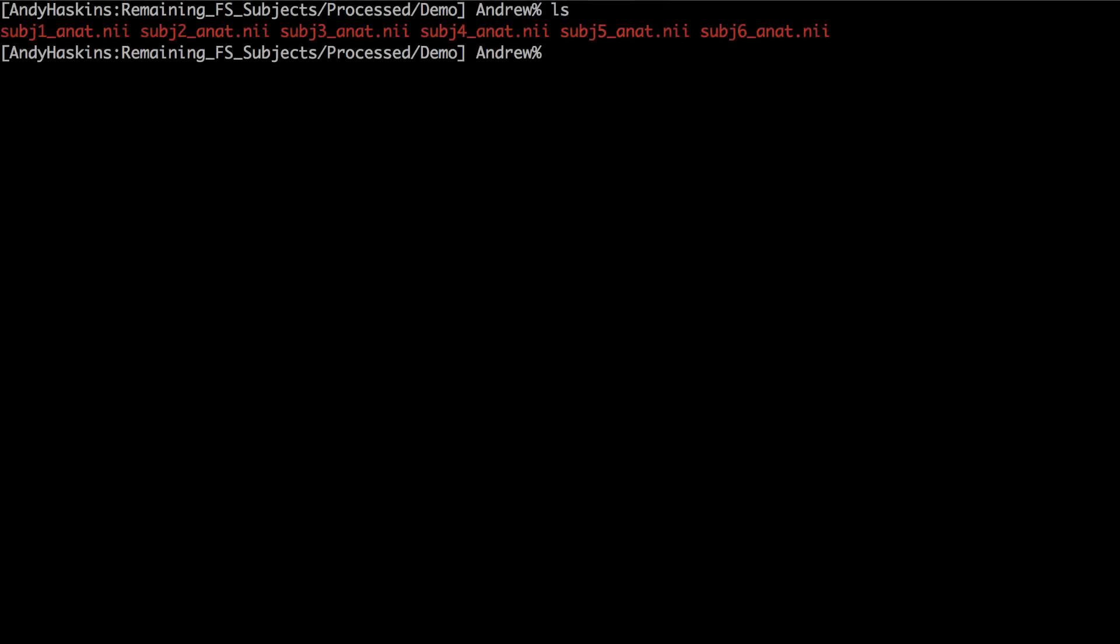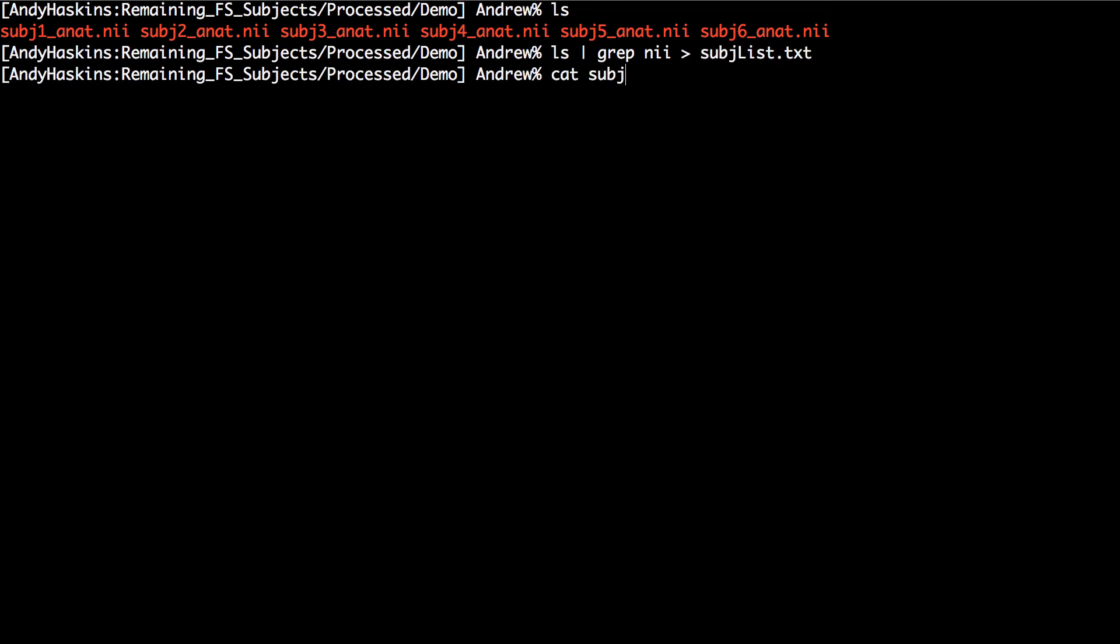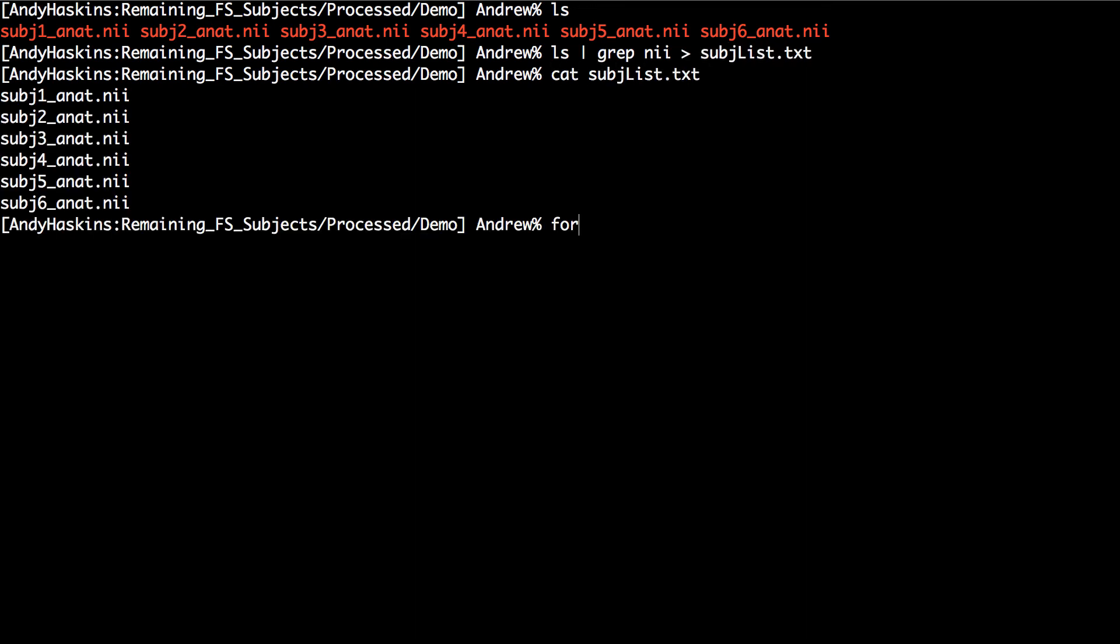To automate this, create a list of your subjects. For example, by typing the following piece of code using grep and put them into the file subject list dot txt. You can use this for loops later.